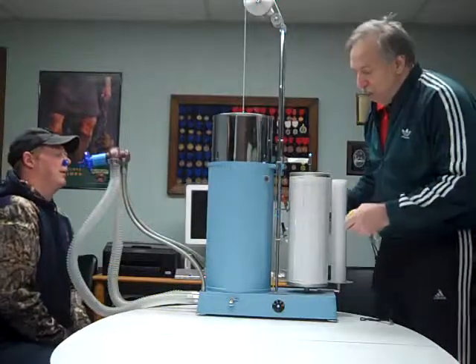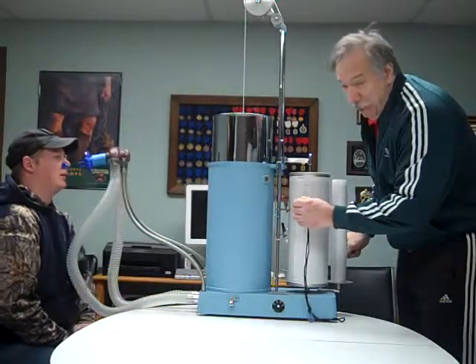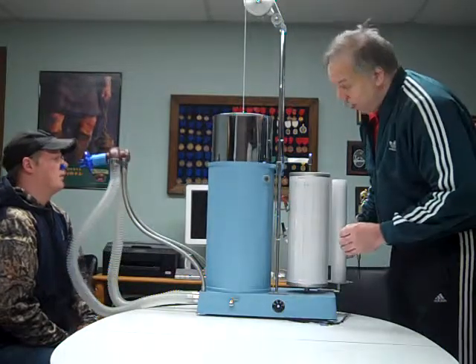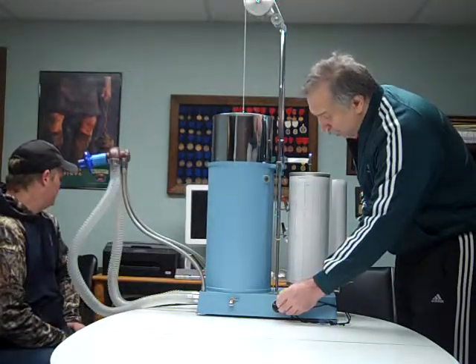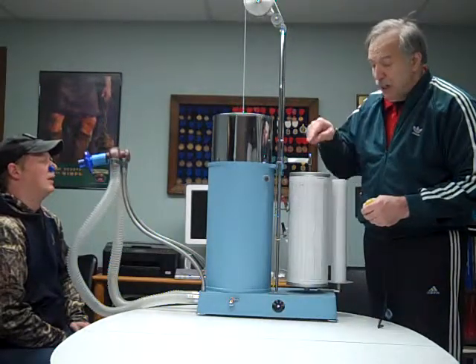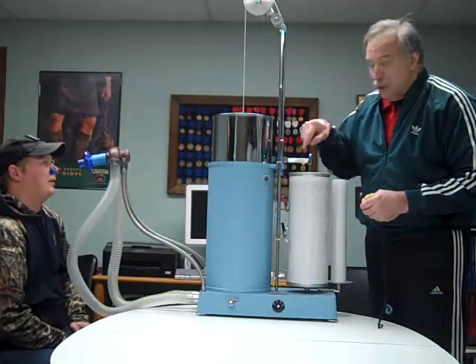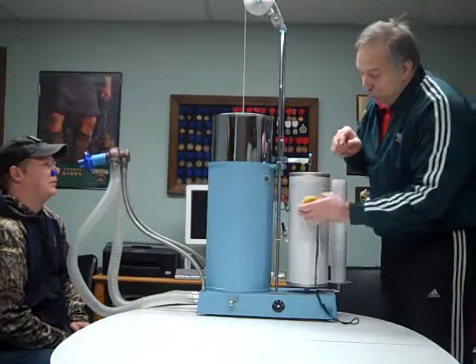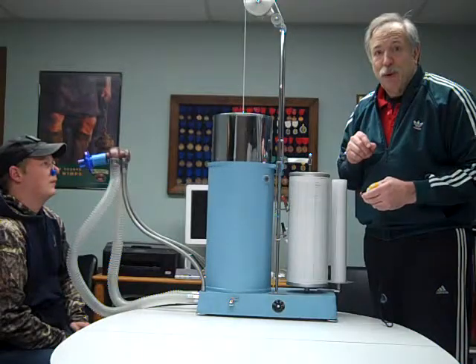We have the machine ready. We have our accumulator pen set up at a height that it won't interfere and draw all over our other tracings. We're going to go ahead and start the paper at the fastest speed, where it's one second between lines, so it just has to make one full rotation. When he's ready to go, we'll just flip the pen and have him start.